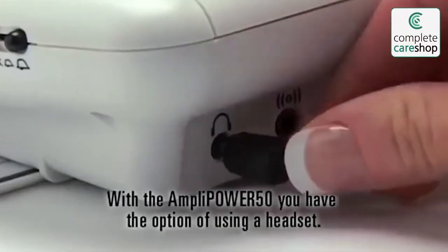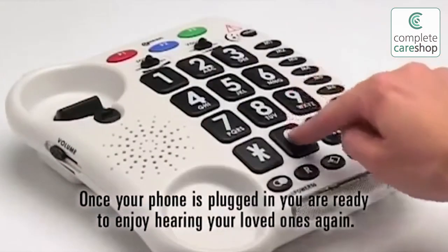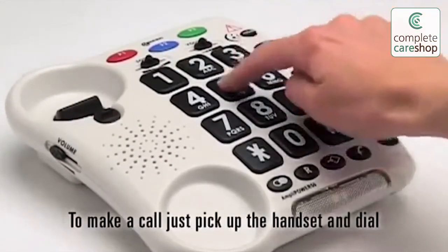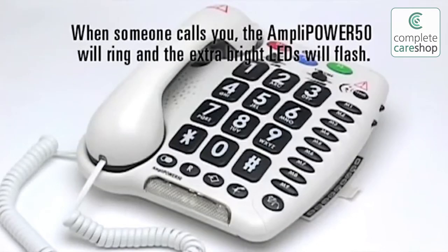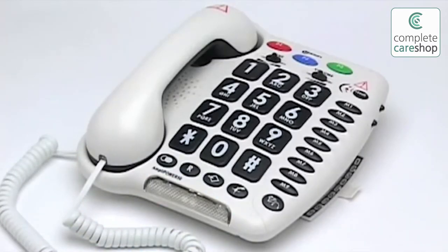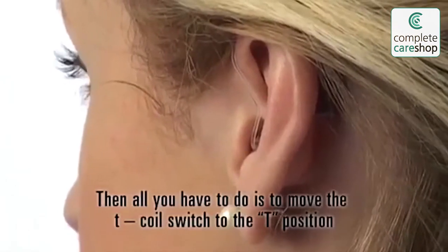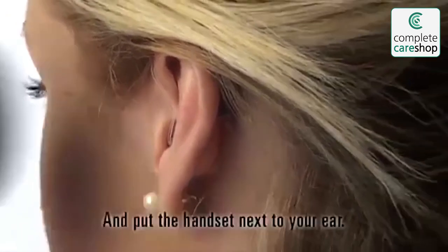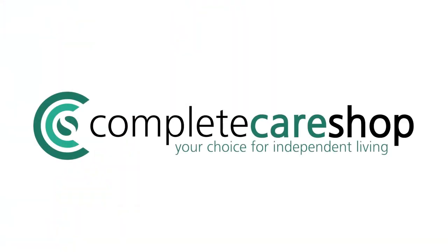With the AmpliPower 50 you have the option of using a headset. Once your phone is plugged in you are ready to enjoy hearing your loved ones again. To make a call, just pick up the handset and dial or press one of your pre-programmed memories. When someone calls you the AmpliPower 50 will ring and the extra bright LEDs will flash — no more missed calls. If you wear a hearing aid fitted with a T-coil, then all you have to do is move the T-coil switch to the T-position and put the handset next to your ear to hear the conversation clearly through your hearing aid.